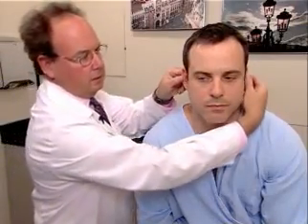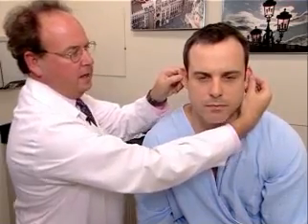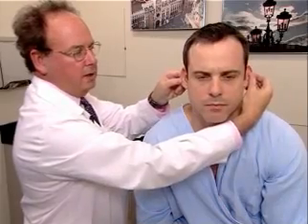We want to palpate also. Mr. Johnson, does this hurt at all? Okay. Tenderness, by pulling on the lobule or the anti-tragus, will provide pain if the person is having an acute otitis externa.